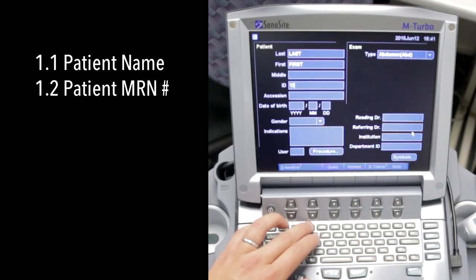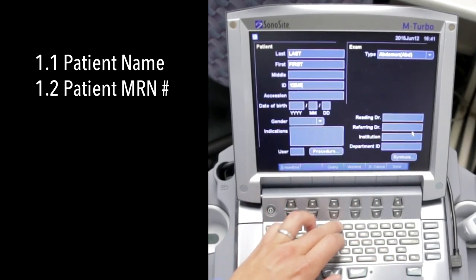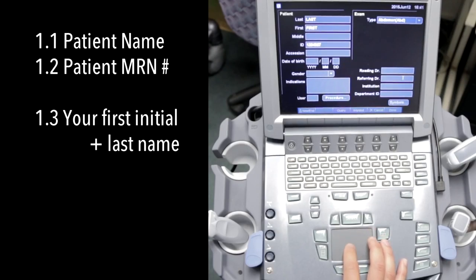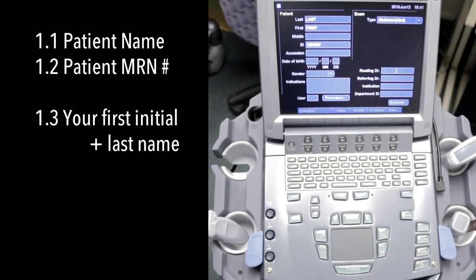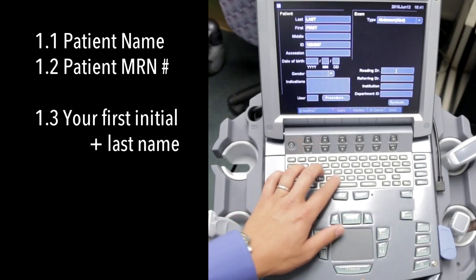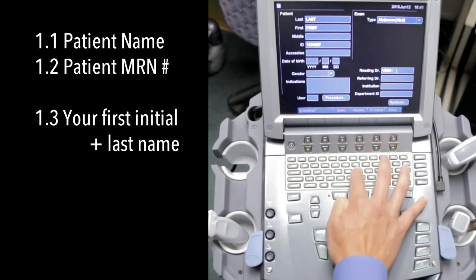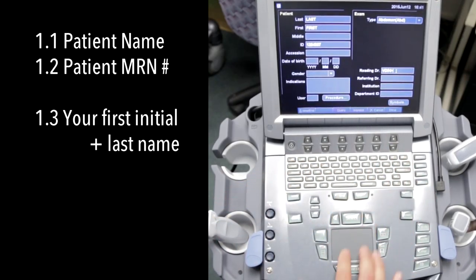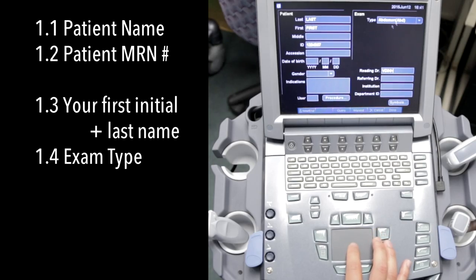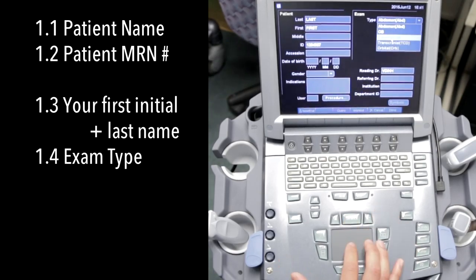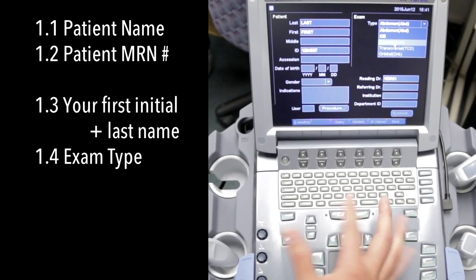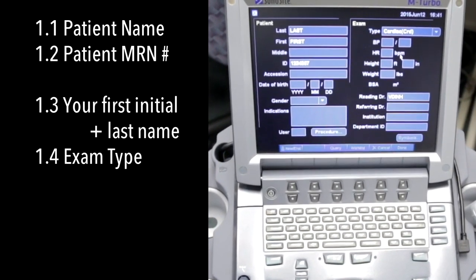So one, two, three, four, five, six, seven. Put your first initial and last name over here, so V-D-I-N-H, and you can also pick the application that you want here. Let's go ahead and go to cardiac.